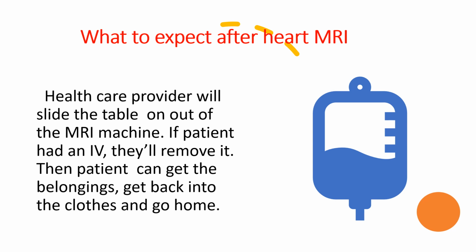What we expect after MRI. So here, after MRI, usually at the time of MRI, the patient may be having IV lines, so that is the precaution. If it's needed, we will be inserting. So after completion of the procedure, we can remove the IV line, and the patient can go for their normal activities.